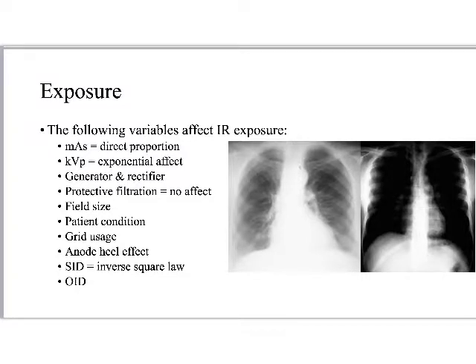Interestingly enough, kVp does some weird stuff, right? So we've dug around and tried to really understand what kVp is doing. But looking forward towards next trimester and safety, what happens to patient dose as kVp increases? It decreases. That's kind of weird, right? Because all of those photons now are just shooting straight through the patient. So it does have its limitations.